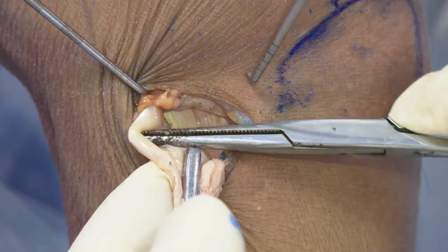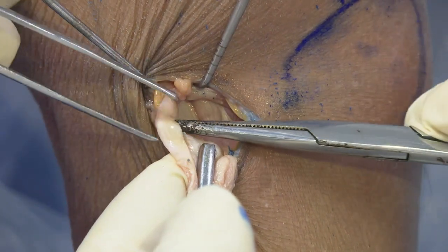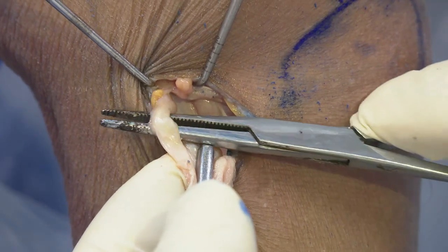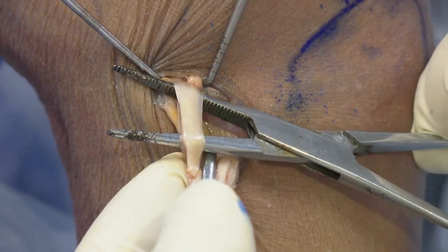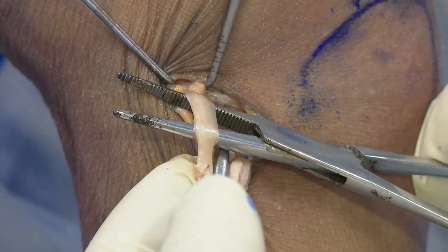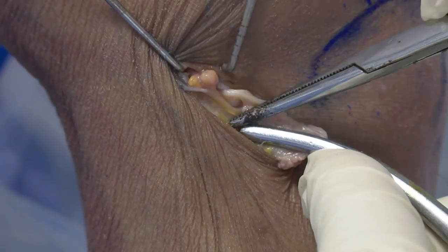我们的这个肌腱方向是横着，斜着，向上的，并不是MCL的走向，这个要注意。Okay, the next step is you identify this tendon, not the whole tendon, just you separate this gracilis from the sartorial fascia. Okay? 然后呢，就把这个股薄肌呢，you see? 从缝匠肌肌膜上面分离下来，outside is the sartorial fascia.